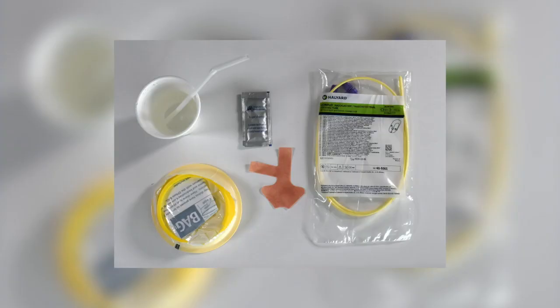The equipment that you'll require will be the nasoenteric tube, a lubricant, the NET adhesive dressing to go on the nose, water in a cup, a straw, an emesis bag, and when it can be accessed, co-phenylcaine spray, which will reduce the epistaxis risk and patient discomfort. We didn't have that available for this particular demonstration.